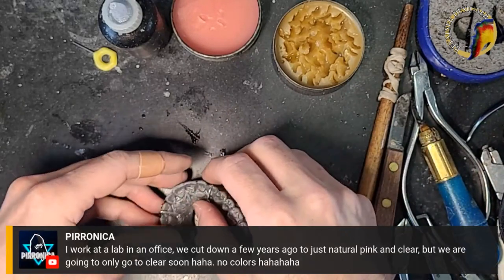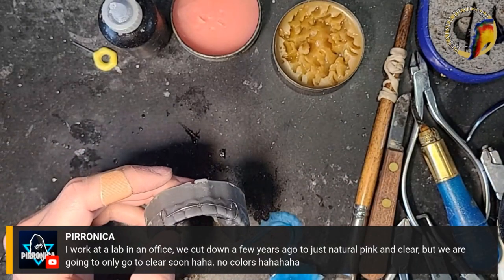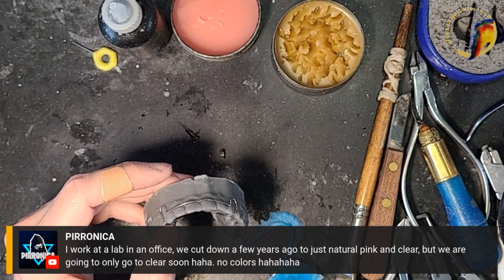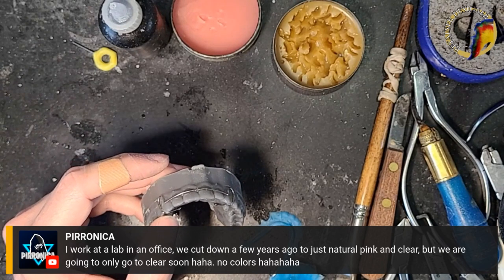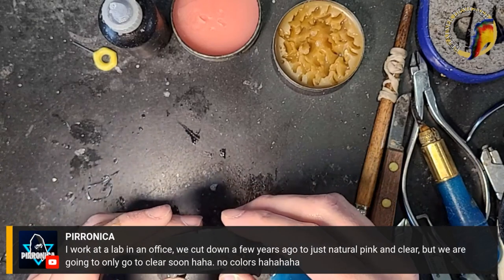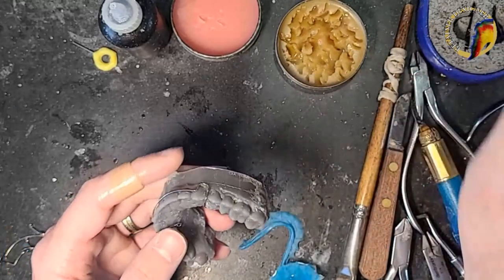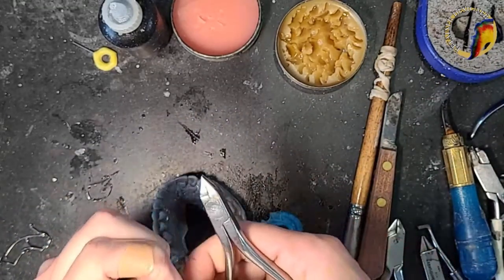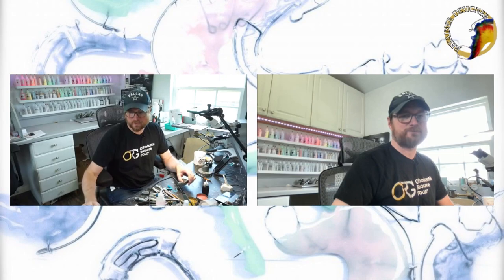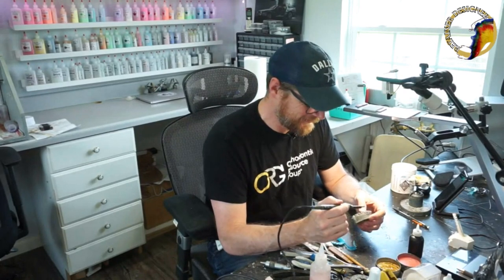All right, so this fits on here pretty good — I'm going to sticky wax it down. I see a little adjustment I can make. Someone in chat mentions their lab only does natural pink and clear, going to clear-only soon. Some offices don't give patients color choices, and I understand — sometimes patients will agonize over the color chart for 30 minutes trying to decide.